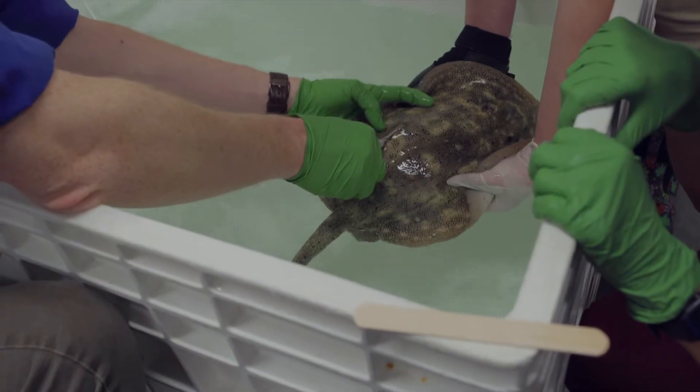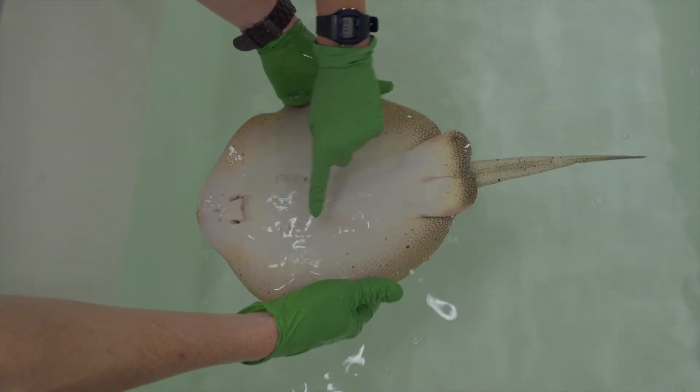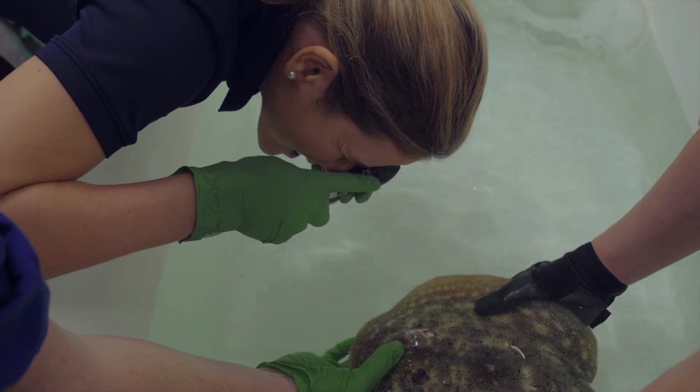One of the other procedures we'll be doing is inserting a microchip — the exact same microchip that most of you probably use for your dogs and cats. It allows us to have a unique identification for this animal.